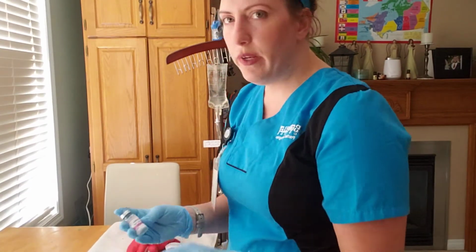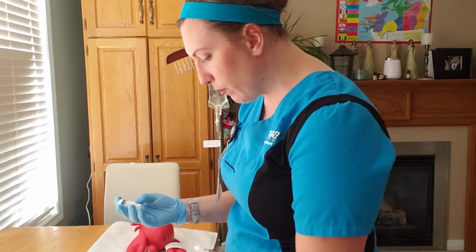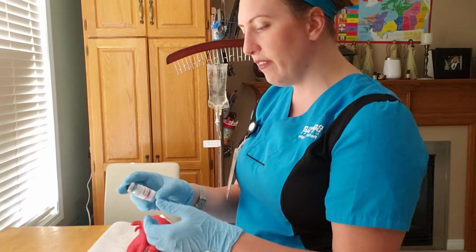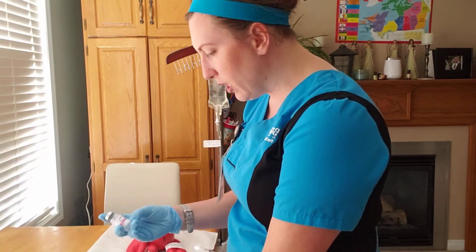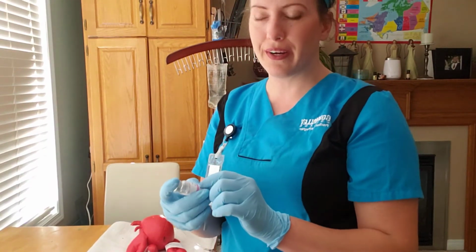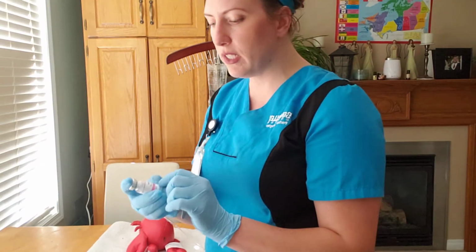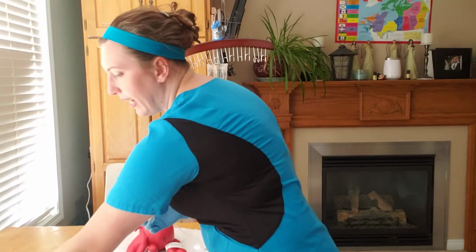Okay, so we don't have patient identification on this vial, but we do know that we're looking for the route, which is IV. It states here on the vial, either IM or IV, so we have the right route. We know that we need 50 milligrams, and in the injection vial, we have 25 milligrams per milliliter, which means we need 50, so we're gonna multiply this by 2, which gives us 2 milliliters. So again, I'm gonna write 2 milliliters as part of my medication math for my total volume.